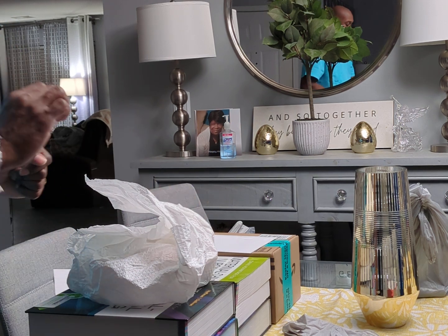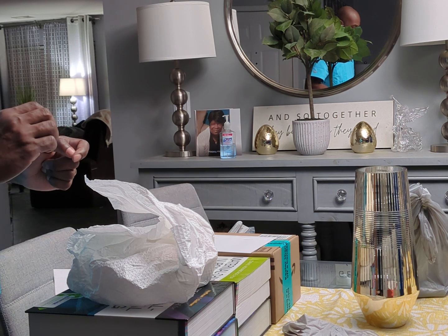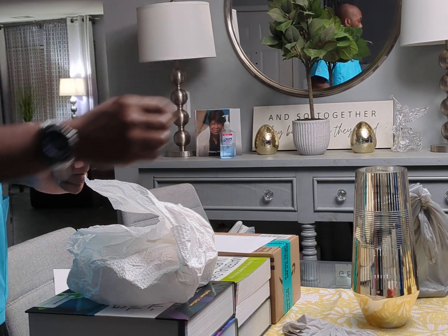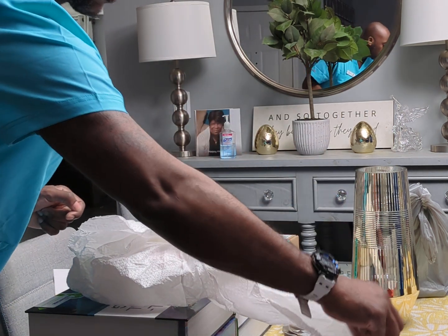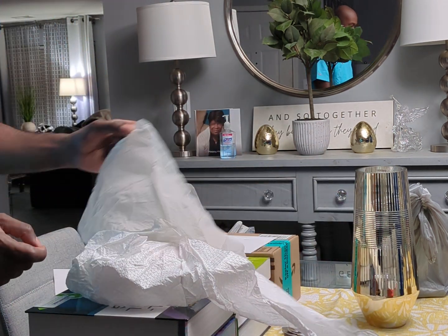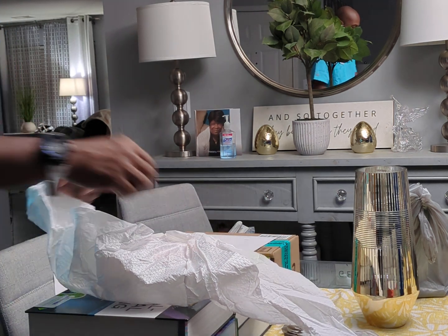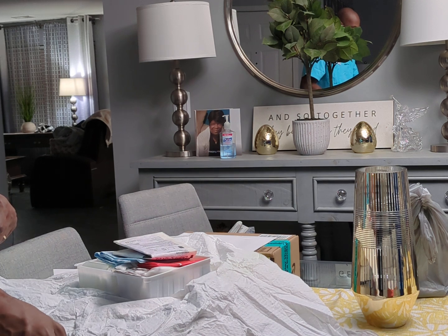So now I'm going to set up my sterile kit. I'm going to open up my sterile kit away from me, okay? Away from me. All right, and now we've got it open.